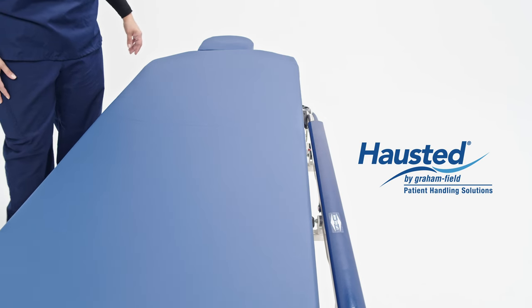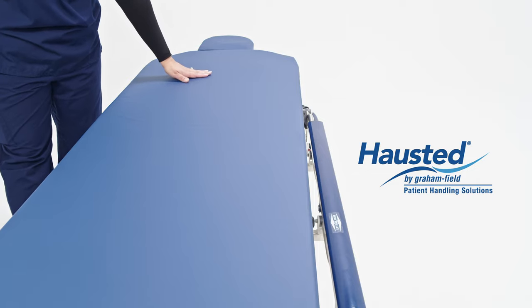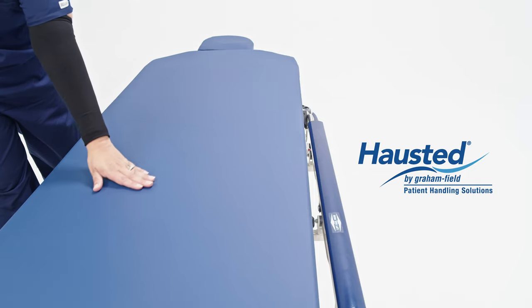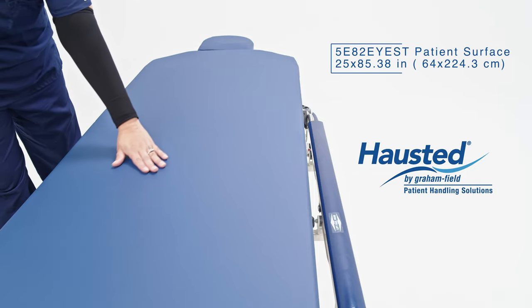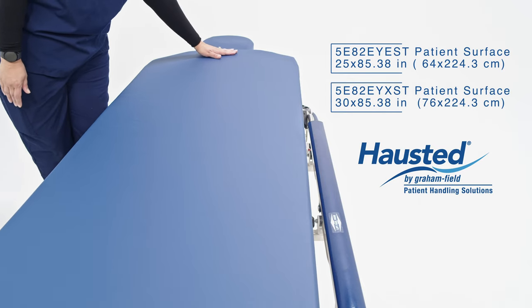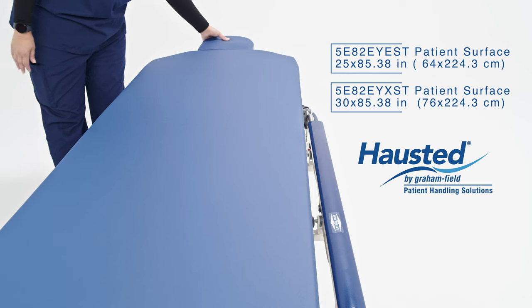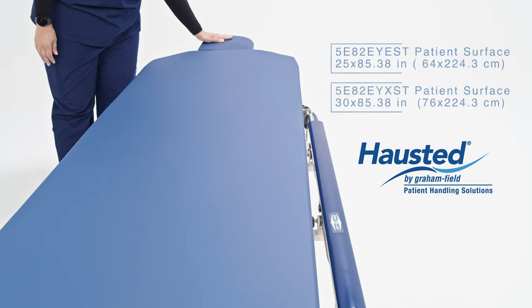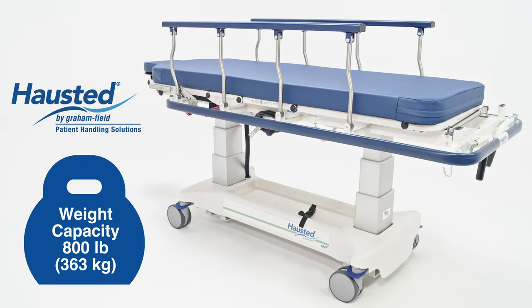Our new stretchers have various patient sizes in mind. The 5E82 EYEST patient surface is 25 inches, 64 centimeters, and for our wide unit 5E82 EYXST, 30 inches, or 76 centimeters. The maximum weight capacity of all stretchers in the series is 800 pounds, or 363 kilograms, evenly distributed.